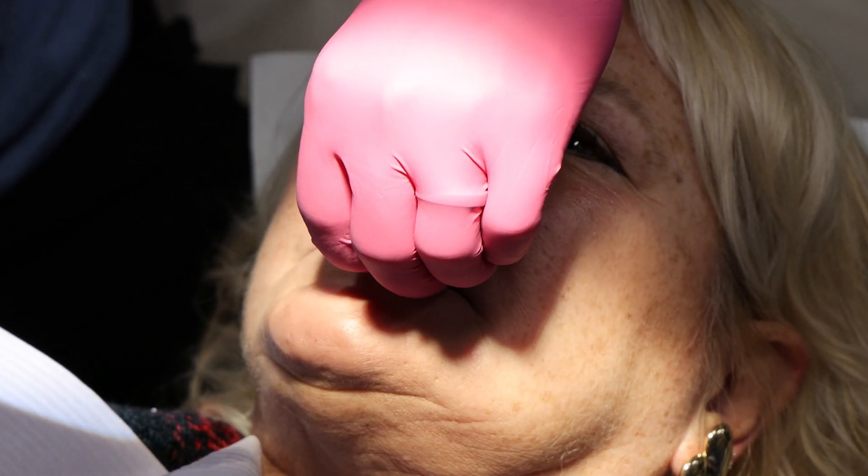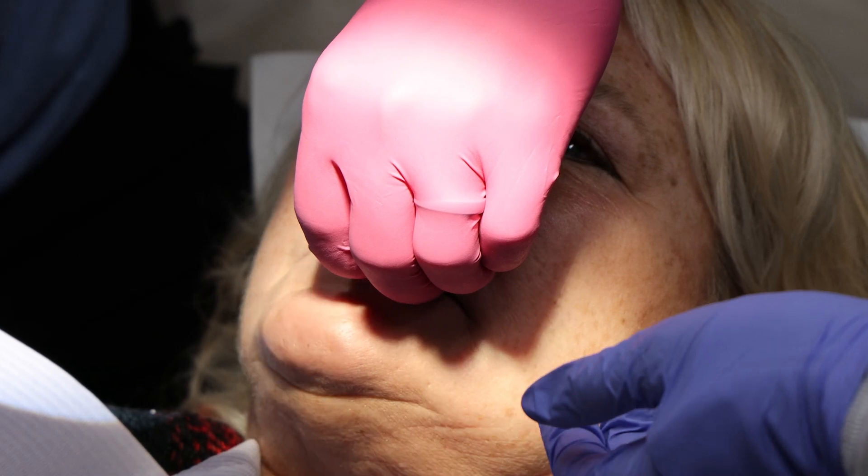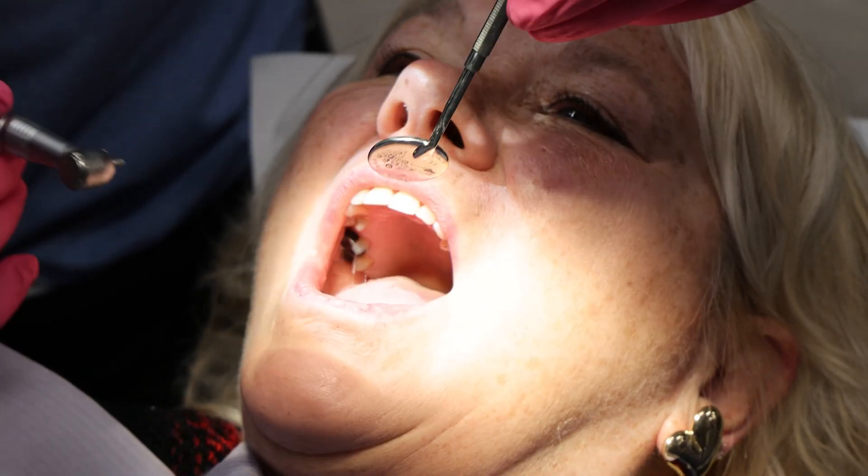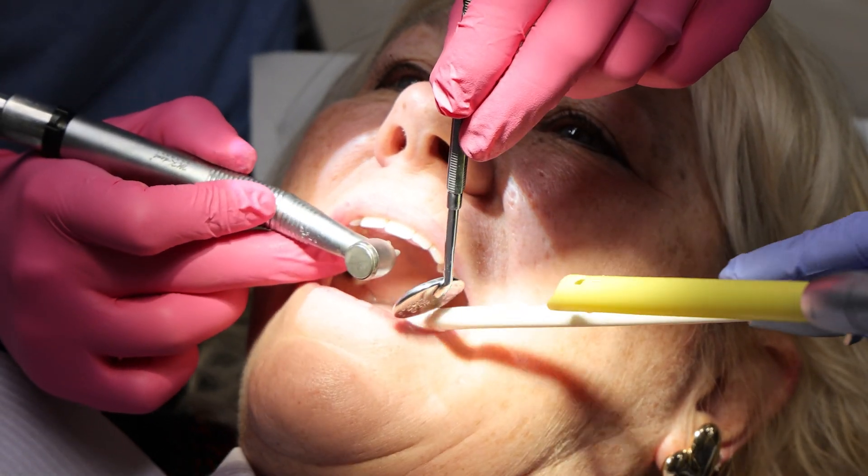Let me try that - better, worse, same? It feels better. Good. I still think this one's a little lower. And I can always do a little more. I'm still hitting it. I want you to hit it, I want you to use it, but I don't want it to be the primary tooth you're biting into. And bite, and open. The marks look pretty good, but I can do a little on the edge here. It's new, and it'll take a little time to adjust, but I want it to be comfortable right away.